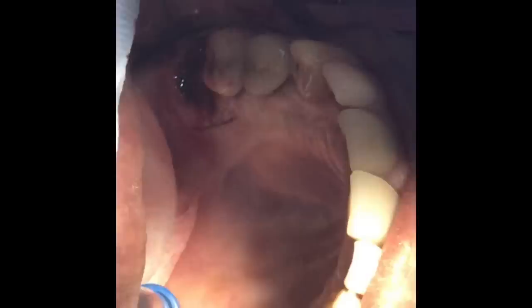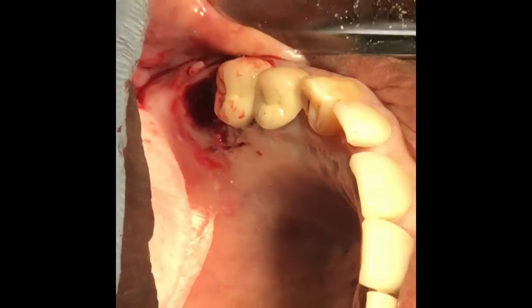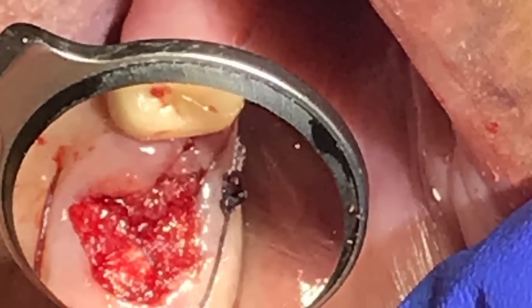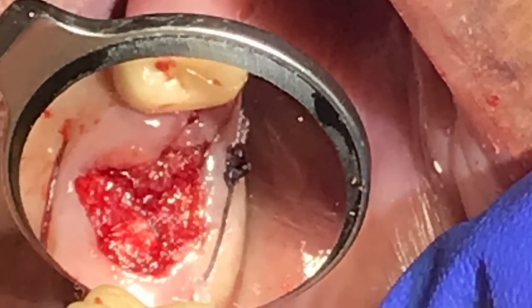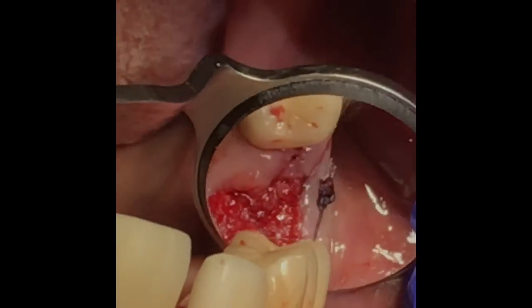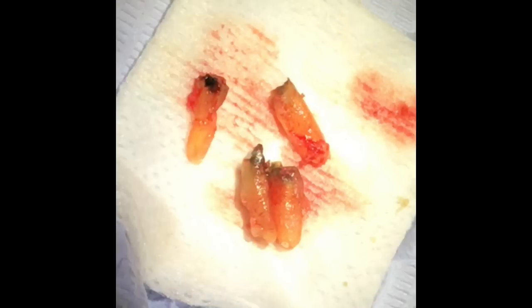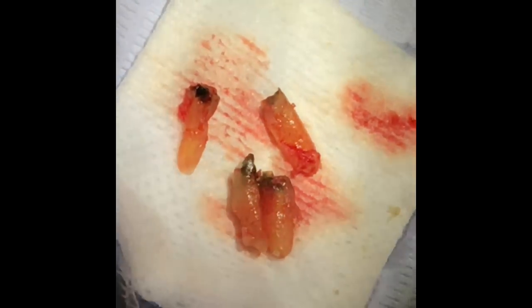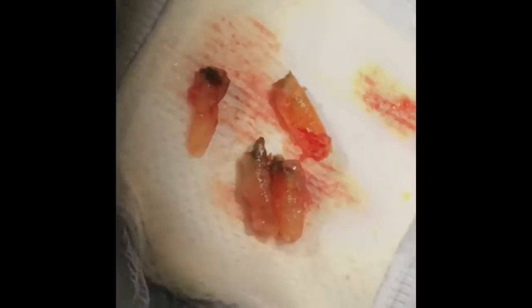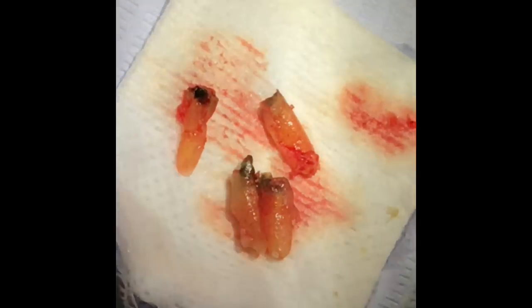This video is simply to help you learn how to take out the tooth. It looks really conservative — there is no surgical flap on the buccal or lingual of the tooth. Four pieces of root come out nicely: mesial buccal, distal buccal, and palatal in two pieces, all came out nicely.